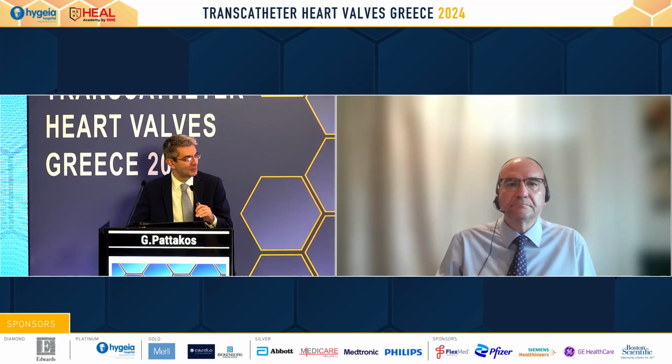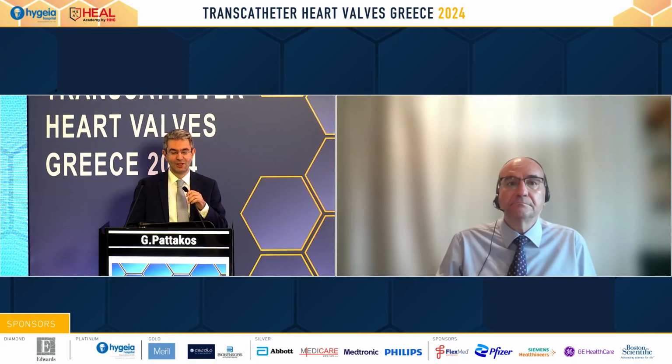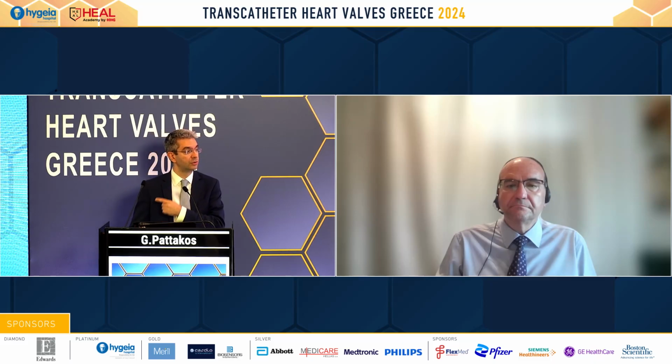100%, and I knew this question was going to be asked because this is what's asked every time that I give a similar talk. So I'm going to turn it square back to you and say it's all your fault entirely. It's the fault of the cardiologists. Come and demand this. You have a lady with a small aortic annulus, you've done her echo, and you know you're not sending her for TAVR, you're sending her for an open operation. So we can do this. So you should find a surgeon who can do this, and you should demand it.